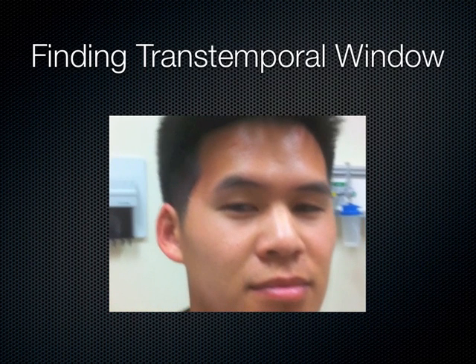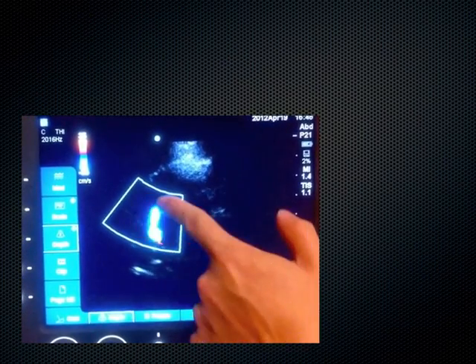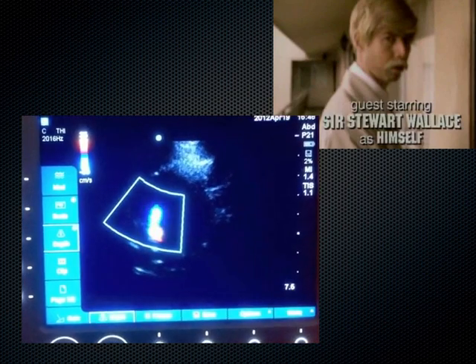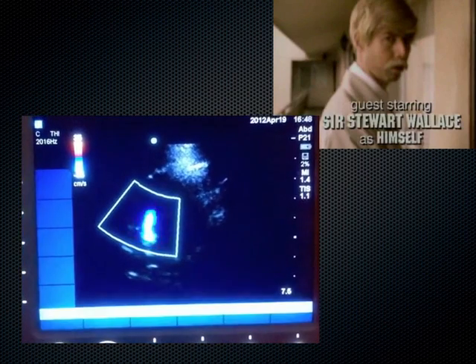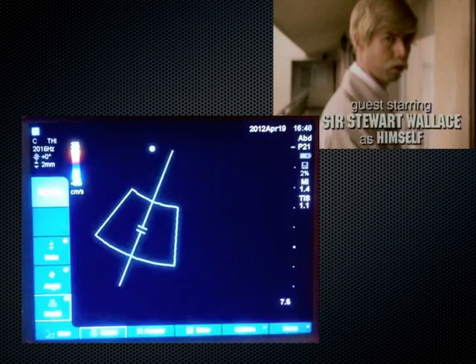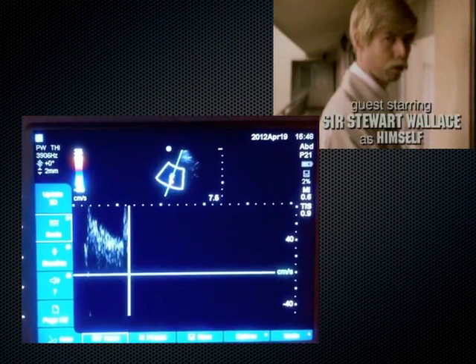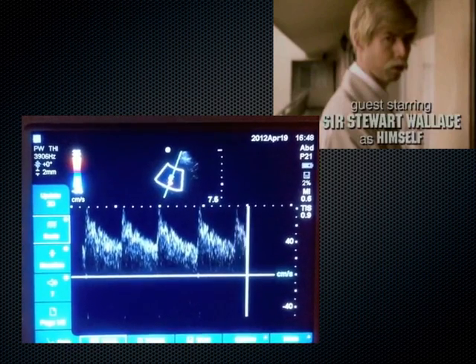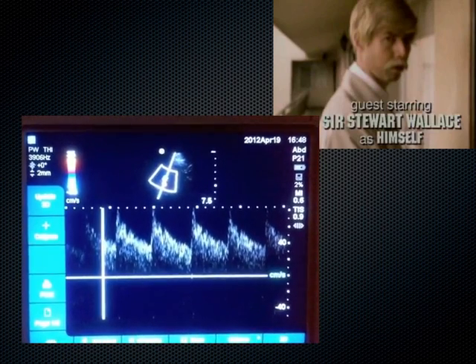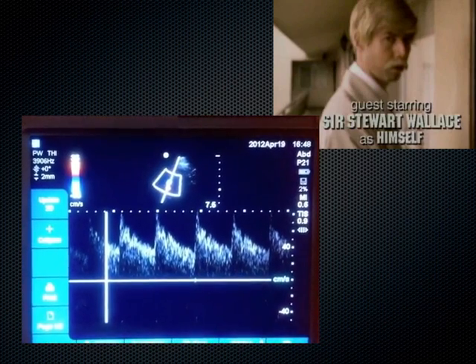So those are those 4 windows that you just saw Alan clearly identify. Now, Alan's going to show you the important vessel in the brain here, the MCA. I'm going to color mode, and here I see the MCA and the ACA, and what I'm going to do is put Doppler on, and hit Doppler again, and what I get is essentially MCA Doppler on pulse wave. This is the systolic flow, and this is diastolic right here.